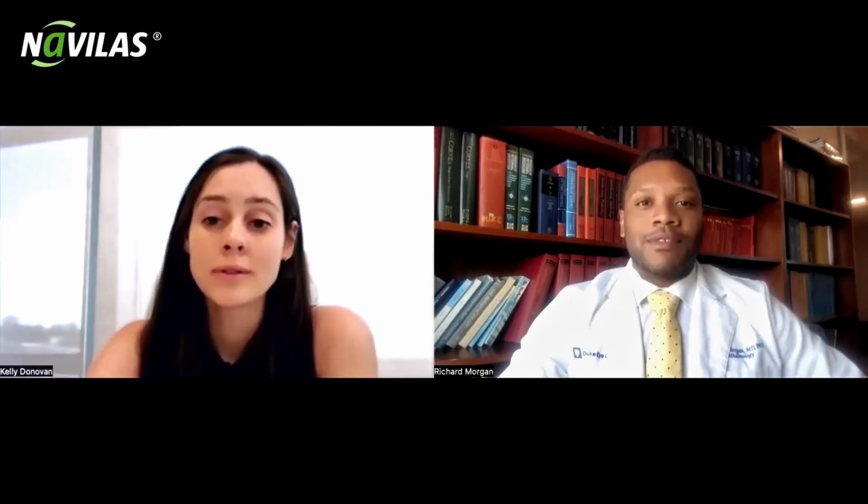So in this webinar, we'll be discussing our experience with the Navilas laser system and how we use it in our training program. I think most ophthalmology residents are very familiar with the traditional laser systems, indirect laser or laser indirect ophthalmoscopy, LIO, or direct or slit lamp laser. And most of these lasers are the tried and true gold standard for a wide variety of retina pathologies. And I guess that most residents get at least some experience with both.